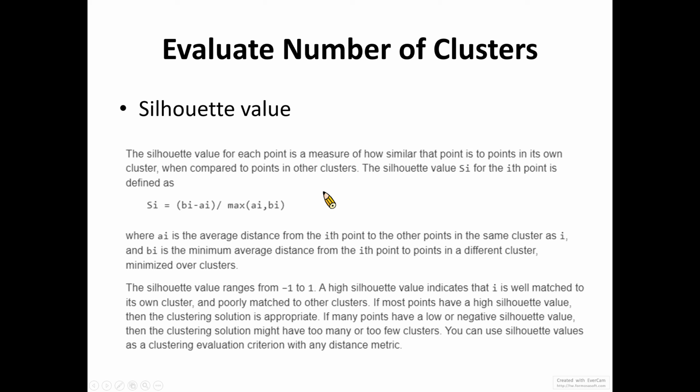So probably the question in your mind is, how do we evaluate the number of clusters? And that is the big question, because there are no standard methods available right now to tell you the right answer.